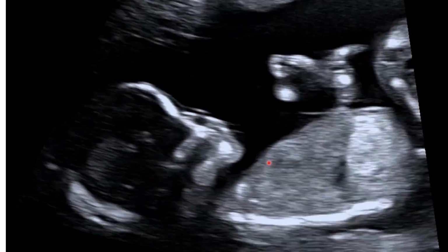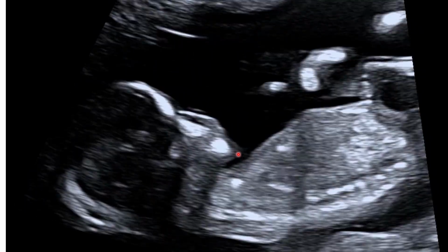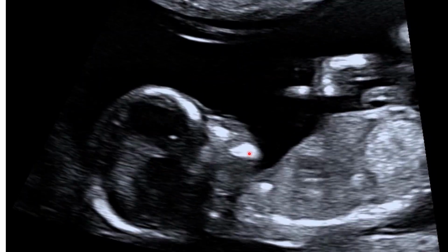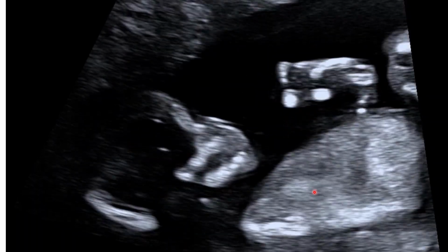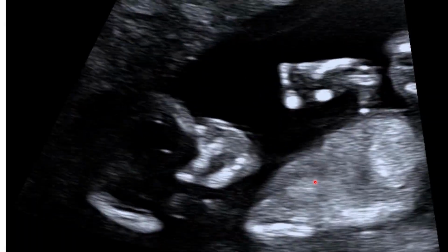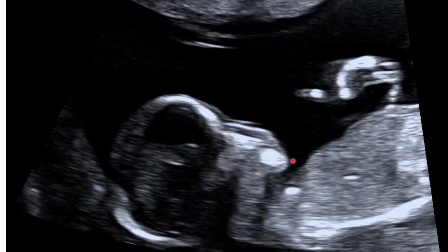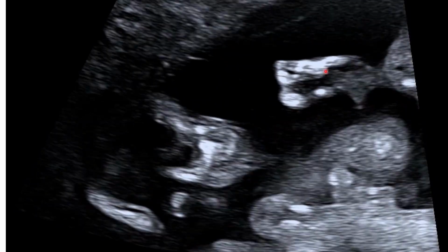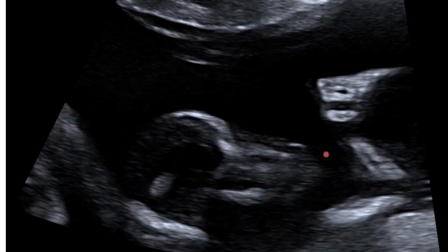You can see that's the heart there, that's the face of the baby, that's the chin of the baby. You can see the heart there. So this is a first trimester ultrasound scan. Look at the foot there. So this was at 12 weeks and 6 days.